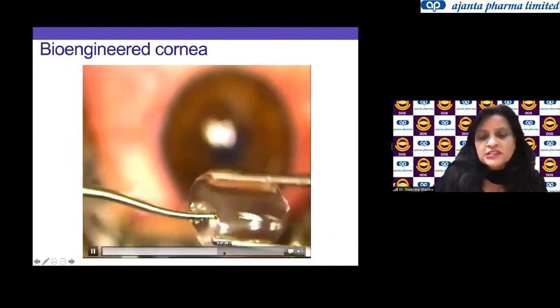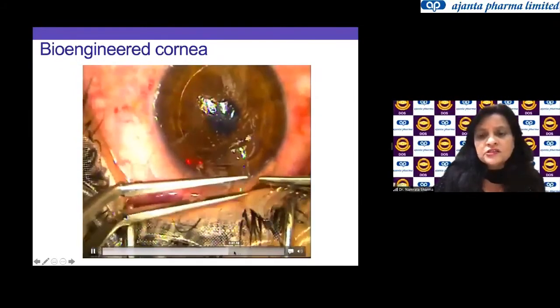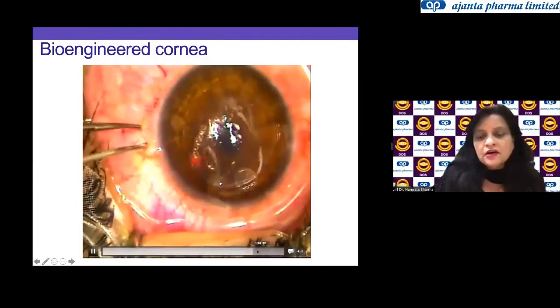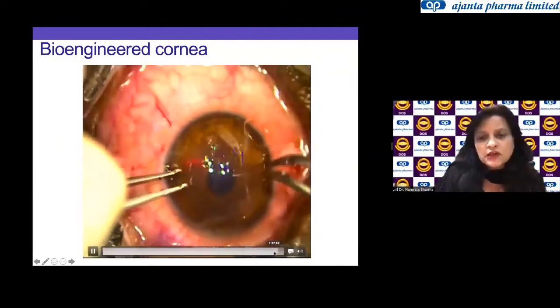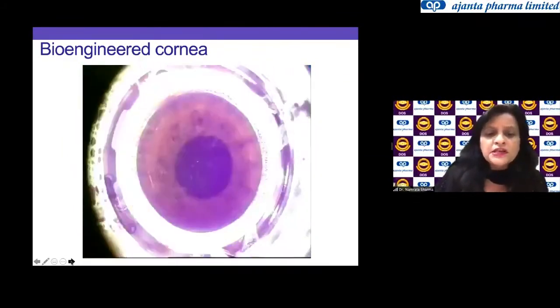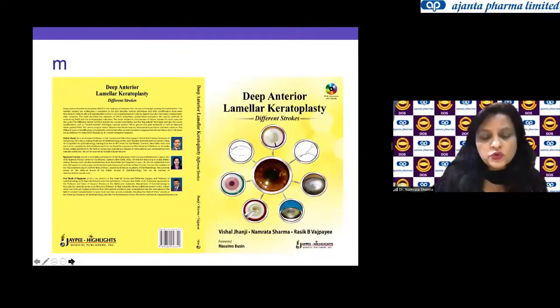And this is folded just as we used to fold our old intraocular lenses on a forceps. This is then placed inside, and this is then unfolded inside the pocket and left sutureless after placing a bandage contact lens. We've started even cross-linking it after putting this inside. So this is something, especially when you have paucity of good quality donor material, this is something to look forward to. And mostly in the corona times when we are not going to be having too many tissues.